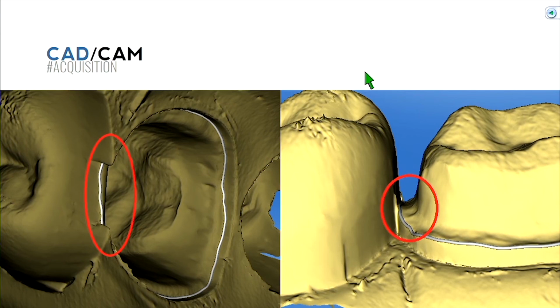They left it too supragingival, meaning the distance between the teeth was minimal. So we wanted at least a 0.5 millimeter separation between your teeth near this contact area. One of the reasons for that, think about the analog method of making a crown.